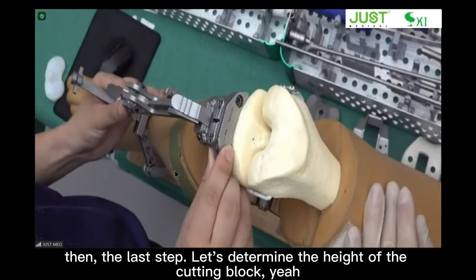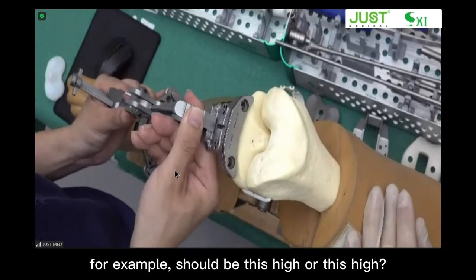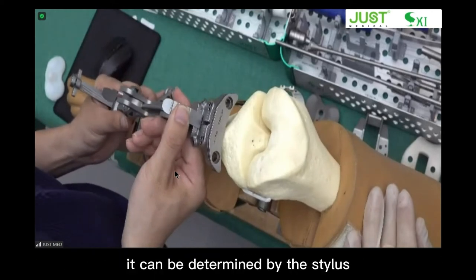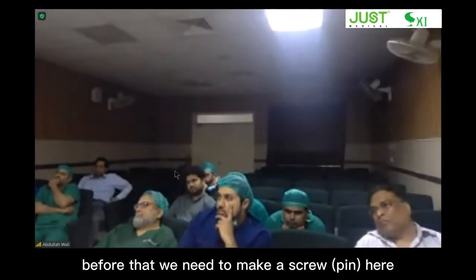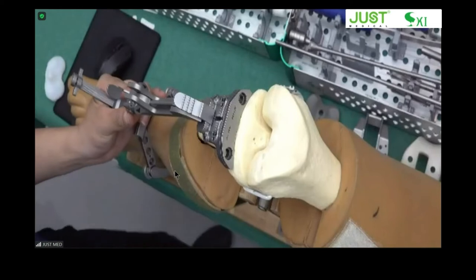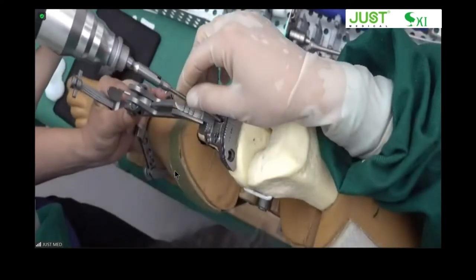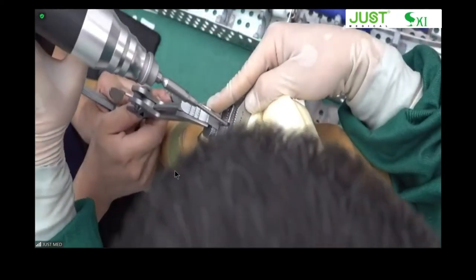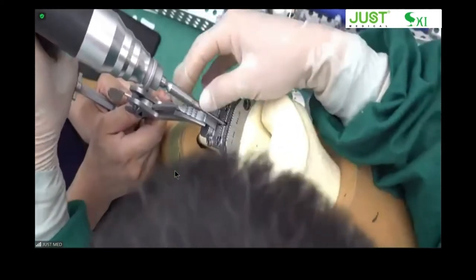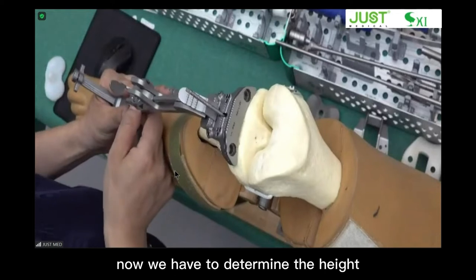Then the last step, let's determine the height of the cutting block. For example, should it be this high or this high? It can be determined by the stylus. Before that, we need to make a screw here, insert a pin. Okay, now we have to determine the height.